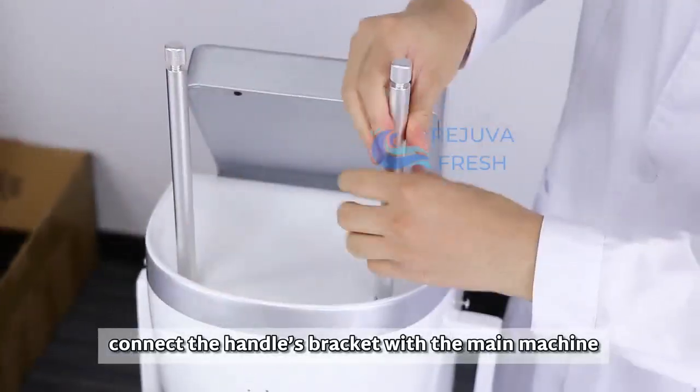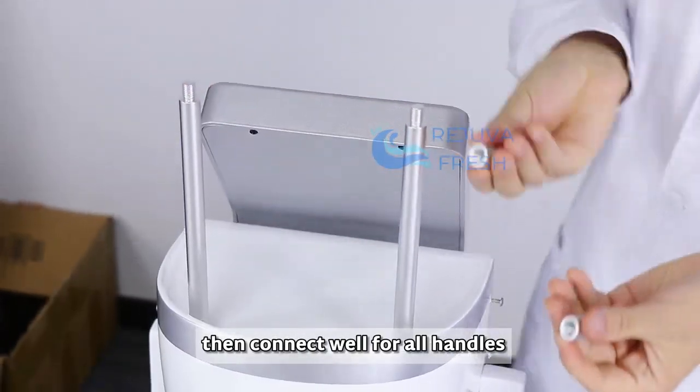First step: connect the handles bracket with the main machine, then connect well for all handles.